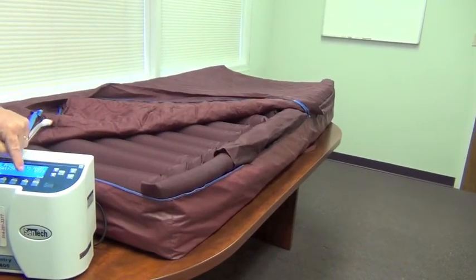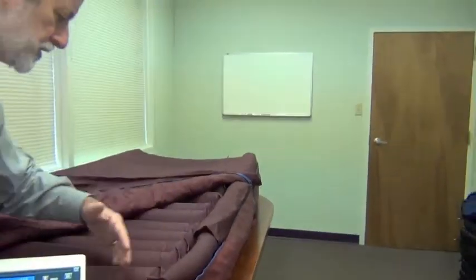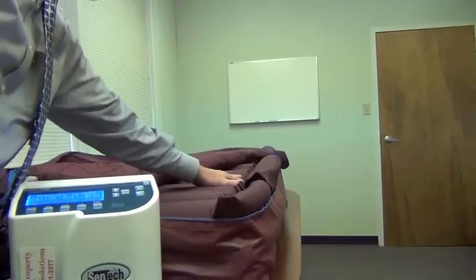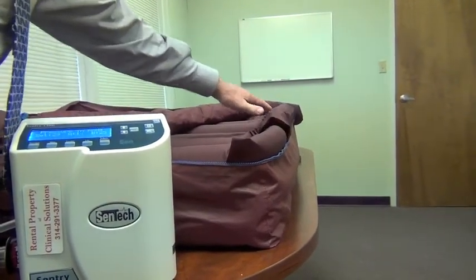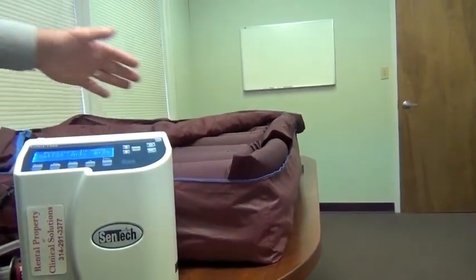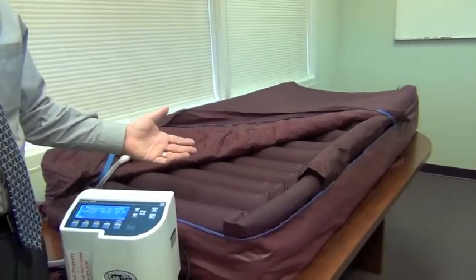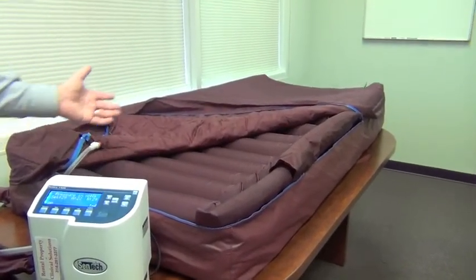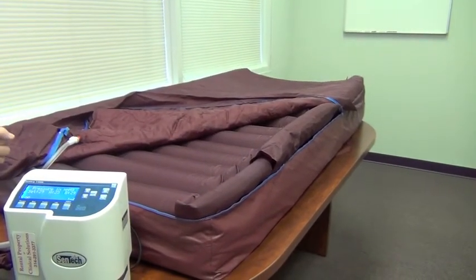When I do inflate them by pushing the soft pad on the air supply here, you can see now that they begin to inflate, and in a matter of a few seconds they're inflated. And they actually add about 3 inches of additional height to the periphery of the mattress. Again, primarily there as a reminder to let the patient know they're approaching the periphery of the mattress. They're a safety feature. They can be deflated.